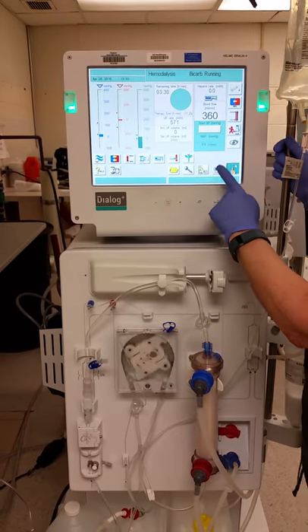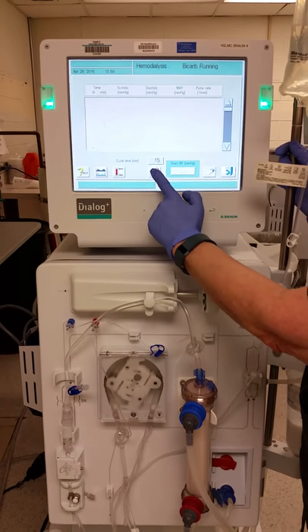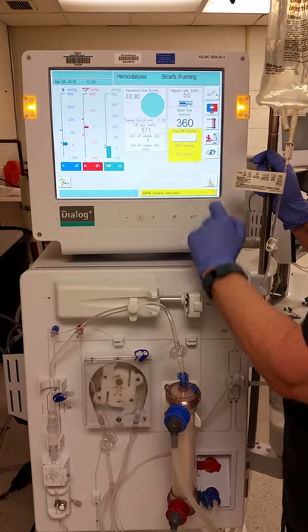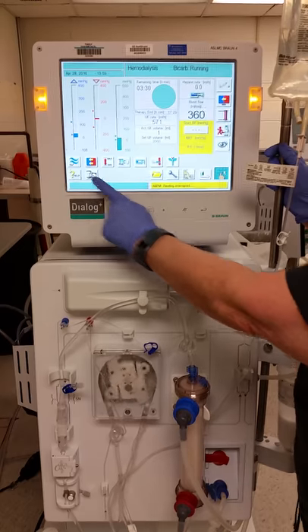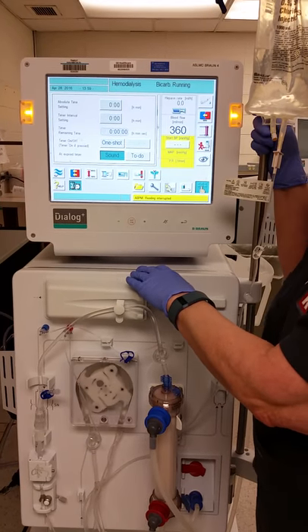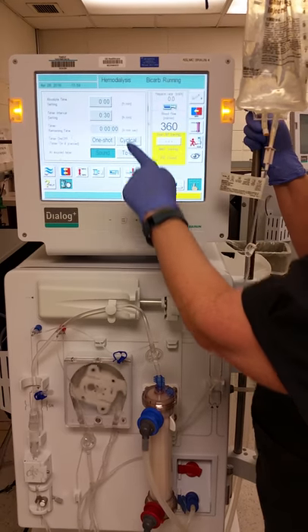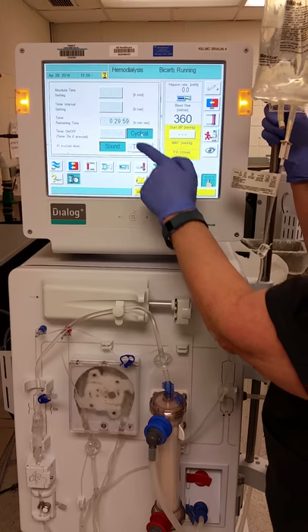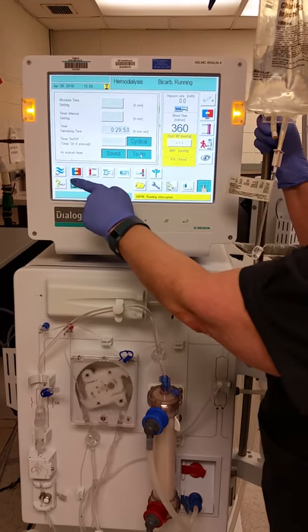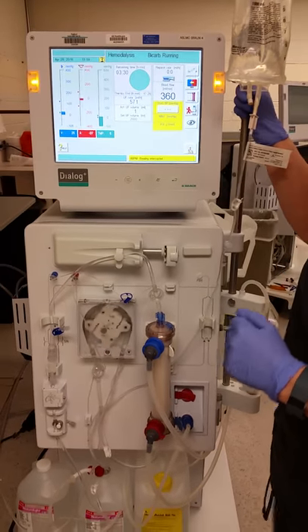Go to the blood pressure screen and set it to cycle every 15 minutes — in the acute setting that's what we need. Press it and it will cycle automatically. For patients that are heparin free, we are required to do saline flushes of 100ml every half hour. Go to the timer, set the interval to 30 minutes, and confirm that the to-do is set to flush. Press OK. Your patient is now running and the different settings are programmed for a good treatment.